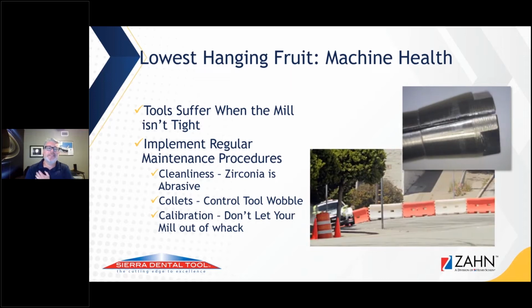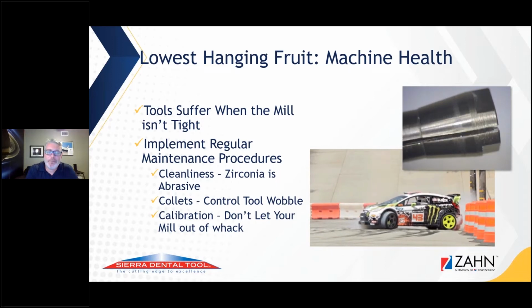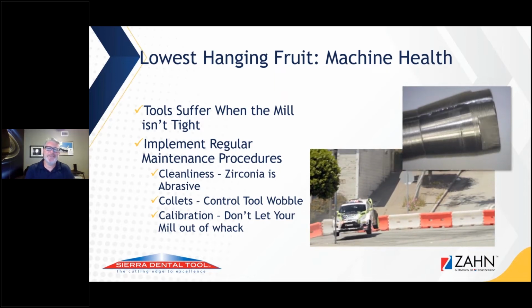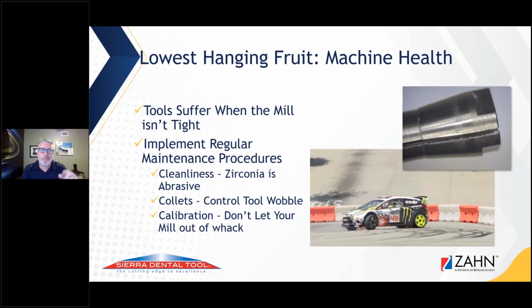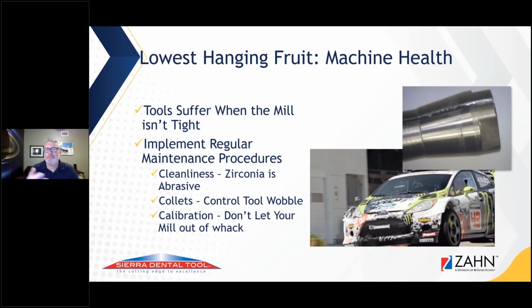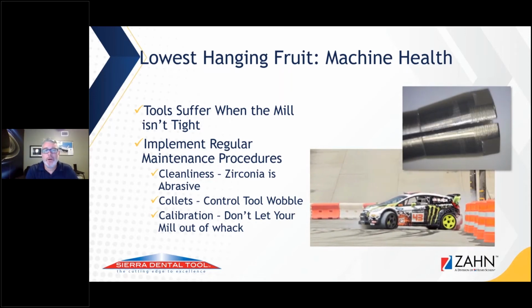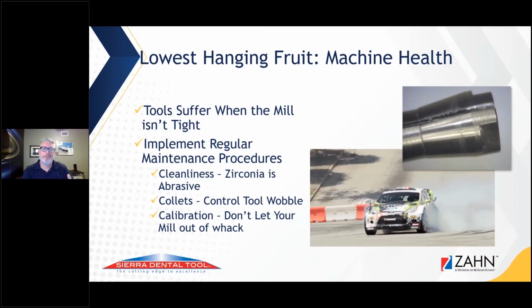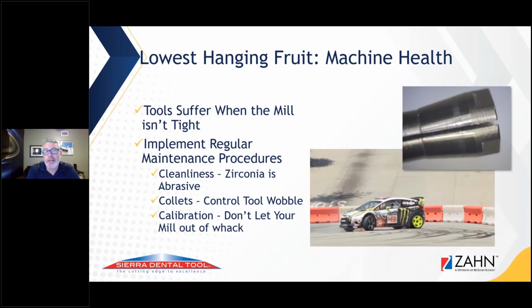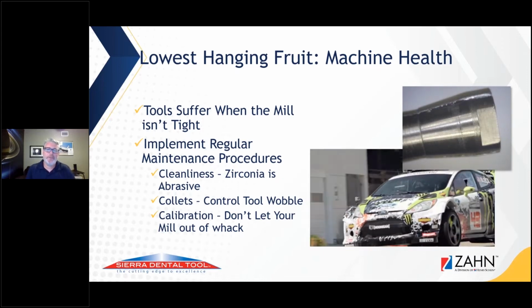So there's a lot of other things here that we don't want to happen because it was lack of maintenance. So calibration, you know, we don't want the mill to get out of whack. That's a big thing that I always used to use, or my term is, that thing's got wacky. It's not working as well as I was expecting it to. Why is that? Is it some other software issue, a connector cable that's not right, whatever that's going on in the mill is not happening. So you've neglected to keep it clean, and that's what really causes our problems. And it really costs a lab a lot of money on not keeping the maintenance schedule on all your mills. So I'm going to emphasize that a little bit as well.